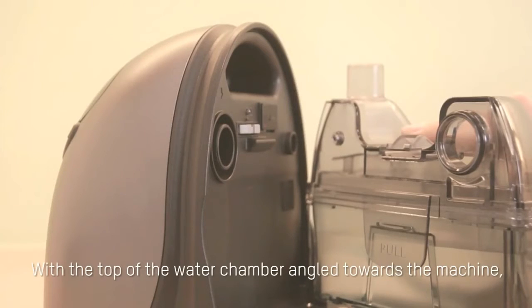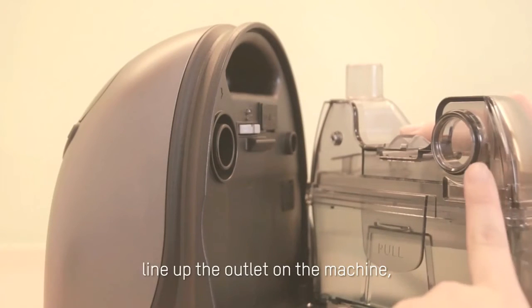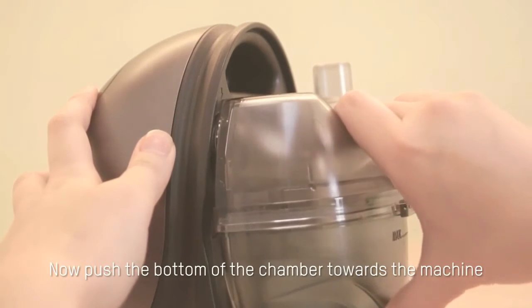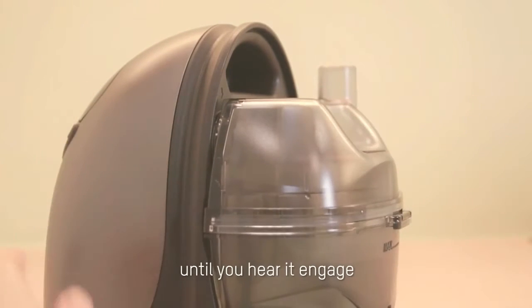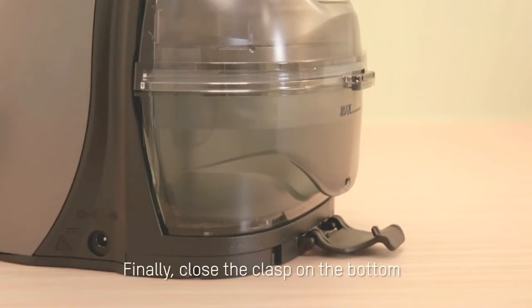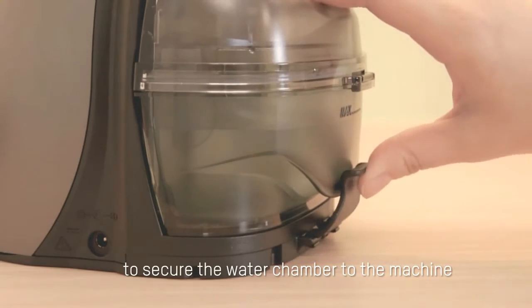With the top of the water chamber angled towards the machine, line up the outlet on the machine with the intake on the chamber. Now push the bottom of the chamber towards the machine until you hear it engage. Finally, close the clasp on the bottom to secure the water chamber to the machine.